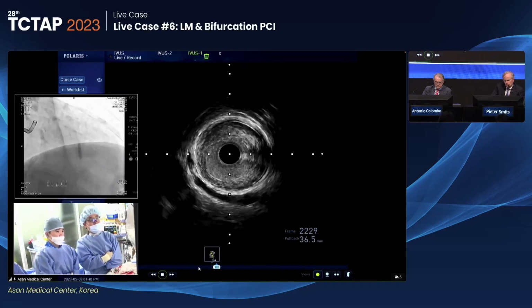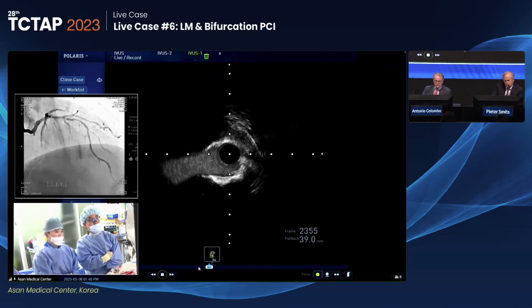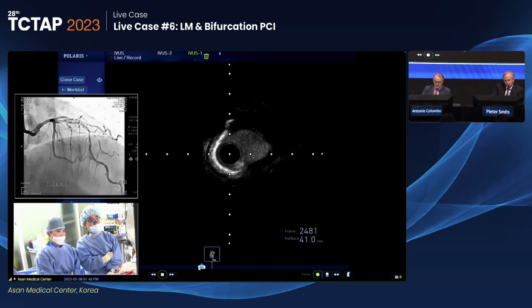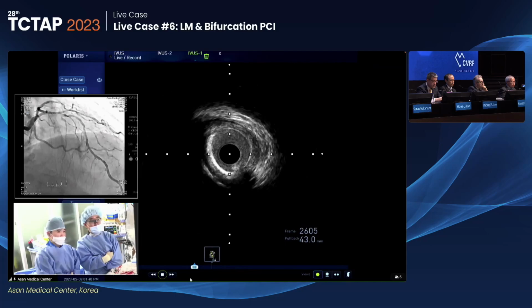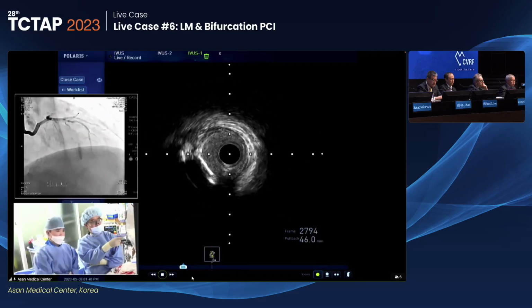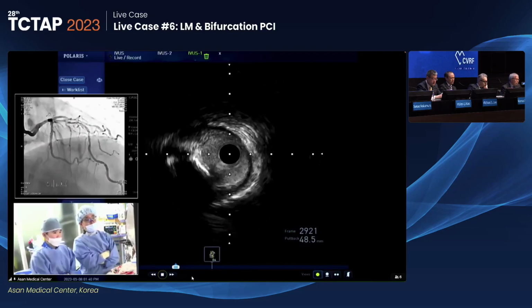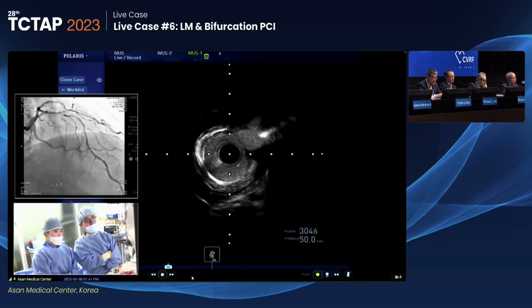Here the septal branch is coming, and the diagonal branch at 1 o'clock. There is a calcified region you can easily find. That would be the culprit region. By angiographic definition, the moving picture showing the calcium is by definition severe calcification. This is the LAD ostium, and the circumflex is coming.